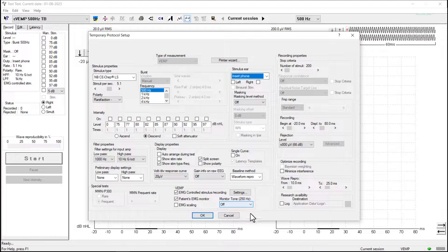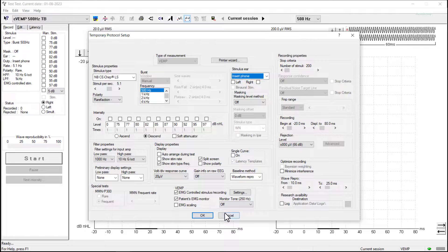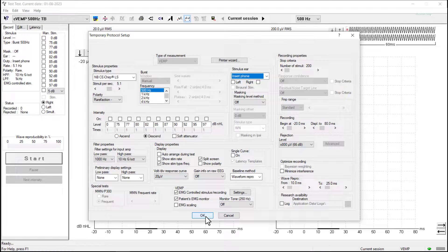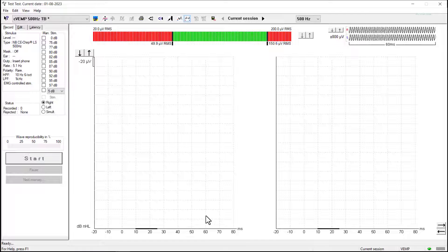So I am happy with all of the settings in this instance here. So we can press ok and then we are ready to start the test.